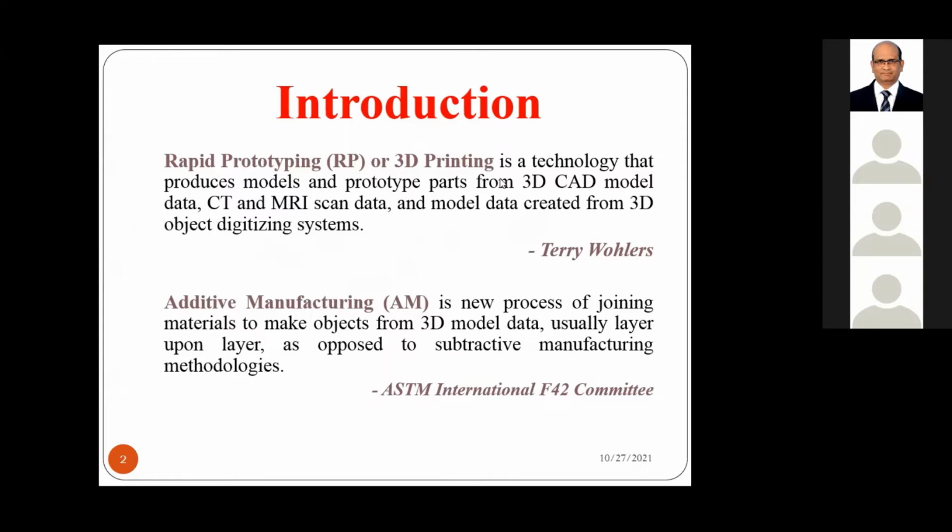From the definition, we can conclude we require 3D CAD data, CT or MRI scan data, and a 3D digital object system, that means a 3D scanning system. How are we going to develop these models, which are useful to the 3D printing software or the 3D printing machines?